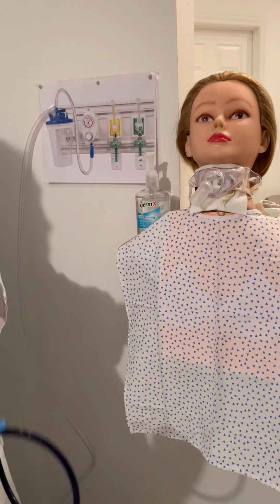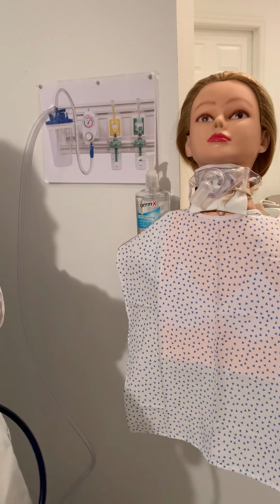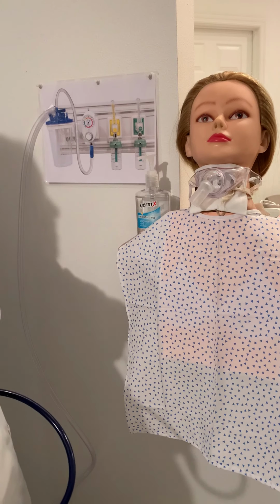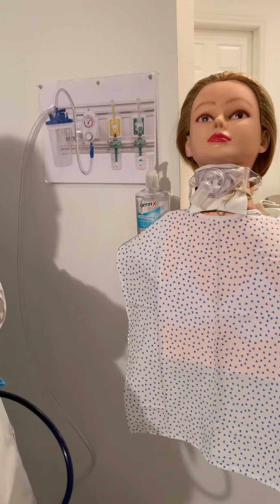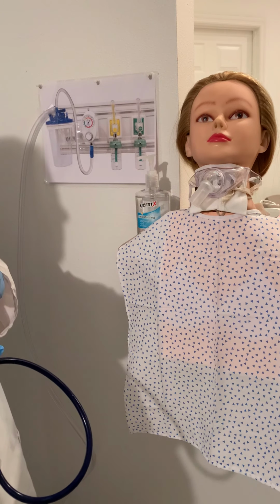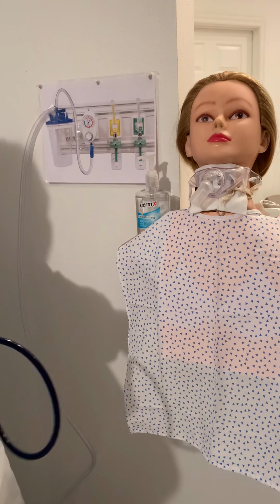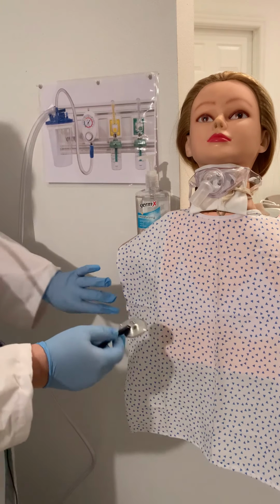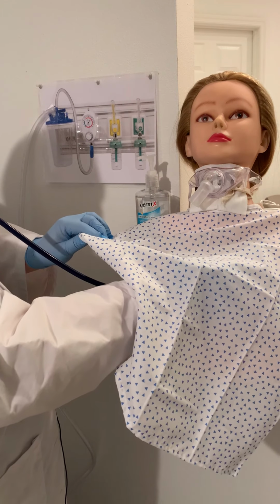We'll check her oxygen on the pulse oximeter, make sure her oxygen saturation is good, check for signs of hypoxia or hypercapnia, which would be an elevated blood pressure, heart rate, respiratory rate, anxiety. She might have some decreased level of consciousness. And then we're going to listen to her lungs, auscultate. We're going to listen underneath the gown so we get the best lung sounds.